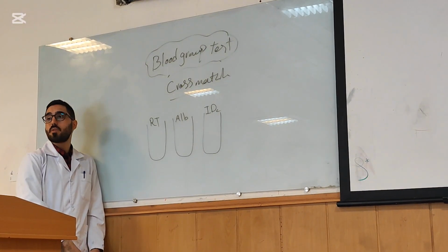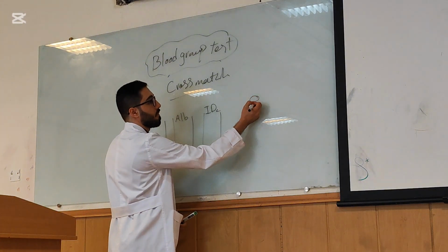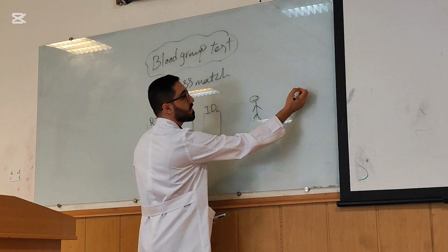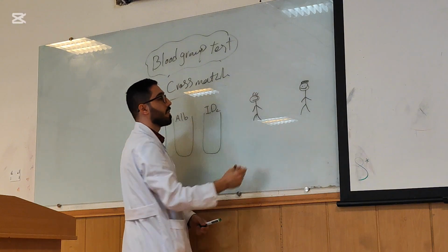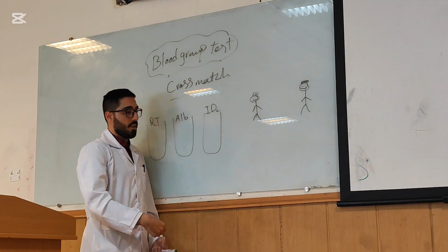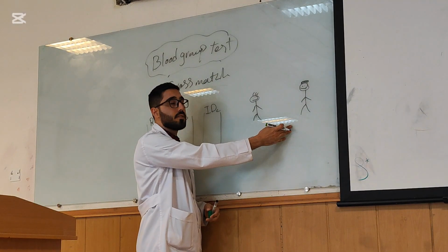You look for agglutination. If we don't see any agglutination, that's me. That's you. I need blood, and you are my donor. Okay?